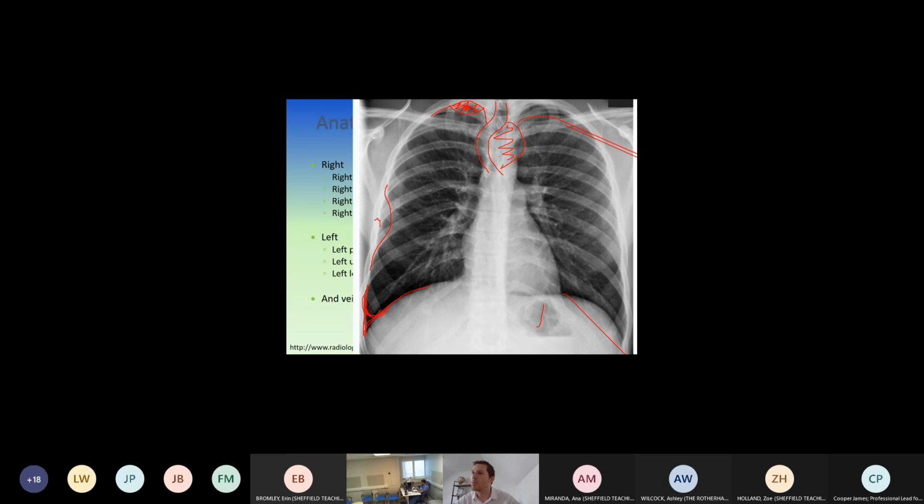We do get slow growing tumours and the likes, but as a general rule, you can ignore these things if they've been there for 2 years. Or look back at CT scans. If you're not confident in looking at the CT scans, you can read the reports. And as a last resort, you can always ring us or email myself and Nick. We're more than happy to review chest x-rays and other imaging for you.